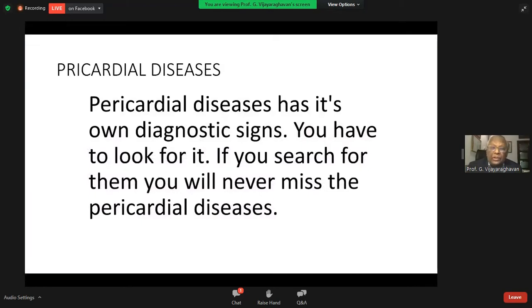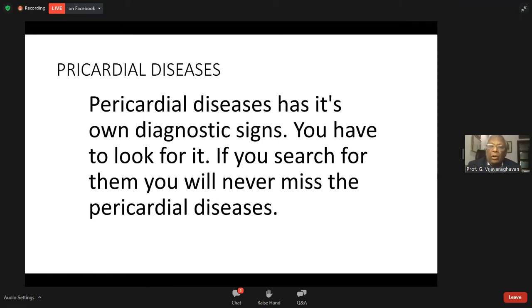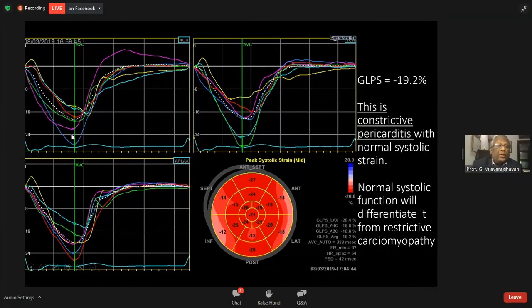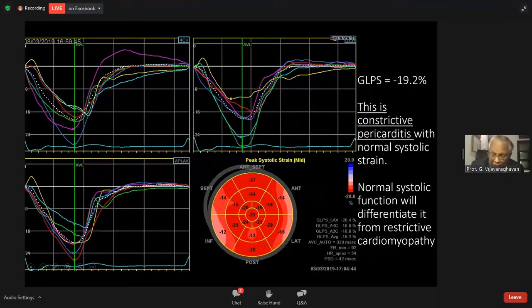The pericardial diseases, as a diagnostic science — look for it, search for them, and you will never miss pericardial disease. Look at the myocardium and pericardial disease. Look at the longitudinal strain. The global longitudinal strain is minus 20.2, peaking apically in a synchronized manner, and it is absolutely normal. The myocardium is normal in constrictive pericarditis.